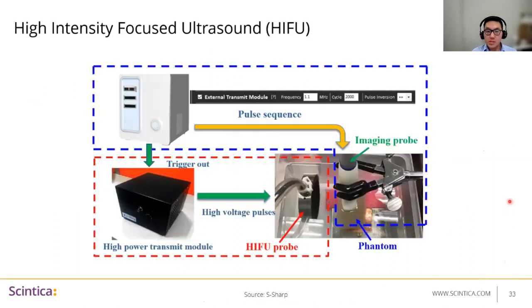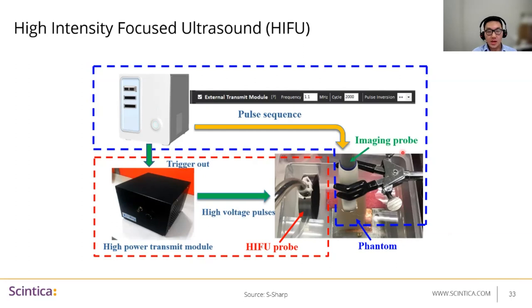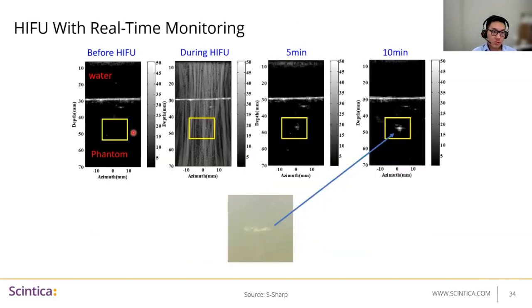There's also HIFU and simultaneous HIFU monitoring, which can be done with the system. In this case, it's a setup with the Prodigy connected to the HIFU high-power transmit module. You can also connect this to the HIFU array unit if you're using an array rather than a single element. You can design your own pulse sequences to do both HIFU and monitoring simultaneously. Example images show the phantom before HIFU and then what's happening during it, monitoring the difference in the phantom at five minutes and ten minutes.